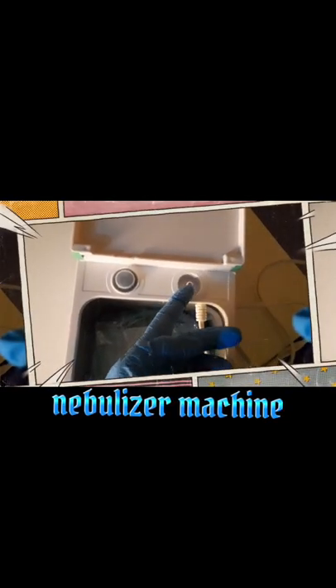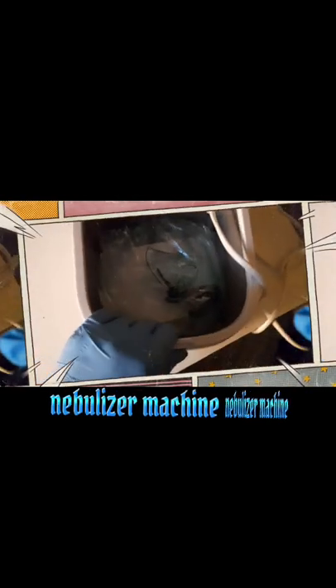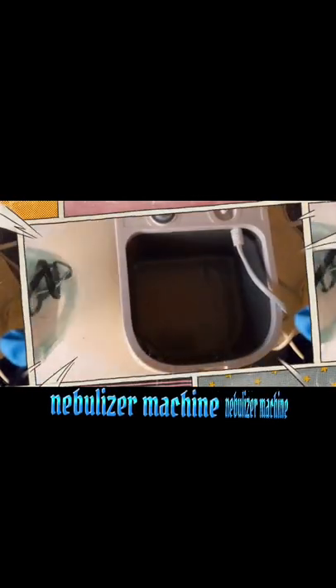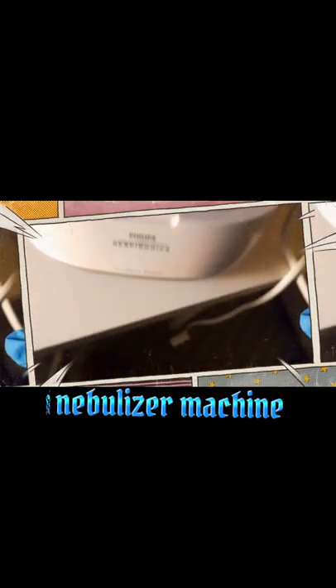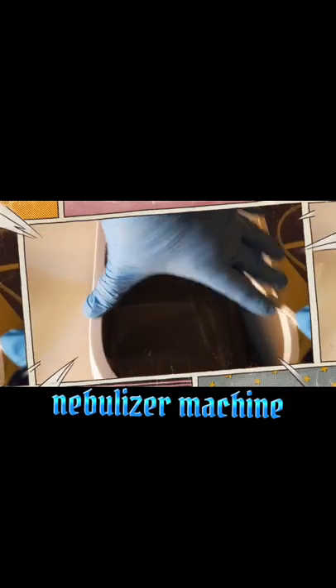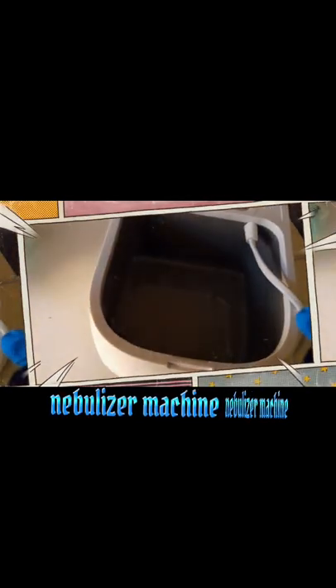The air will flow through the nozzle, which is the connector for the nebulizer mask. This is the inner compartment of the nebulizer machine — see how deep and wide it is. You can keep your nebulizer mask in the compartment and even store your medicines inside.